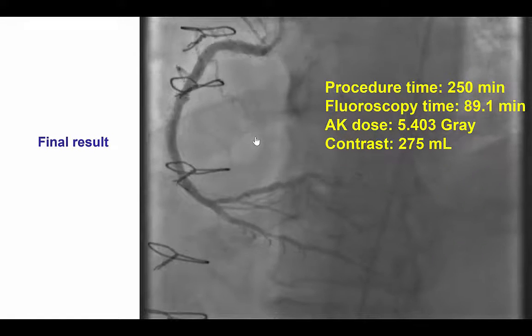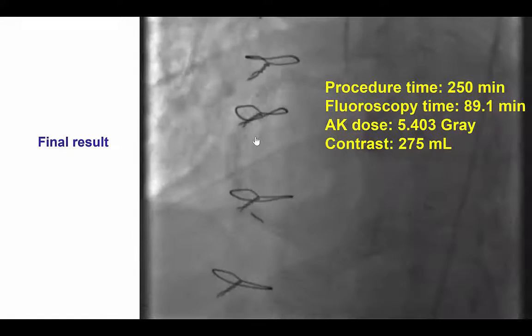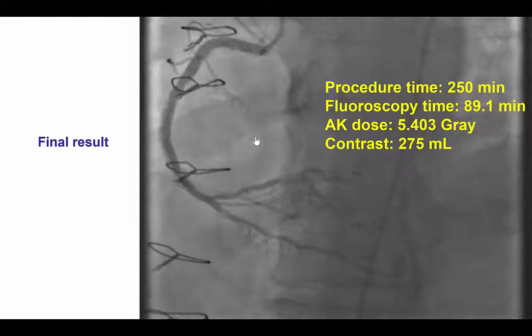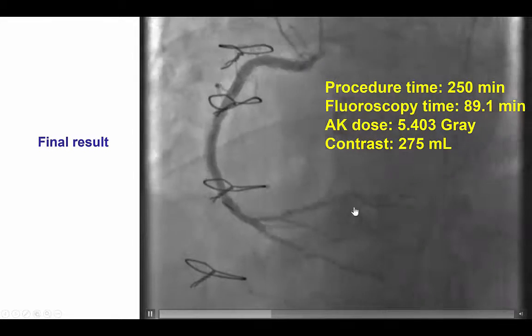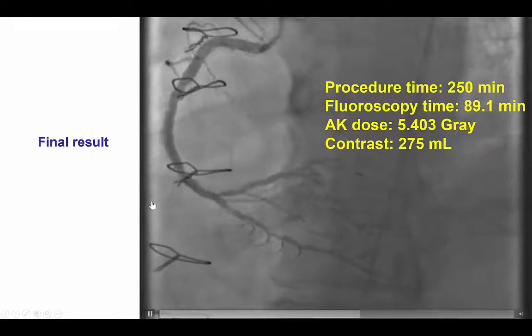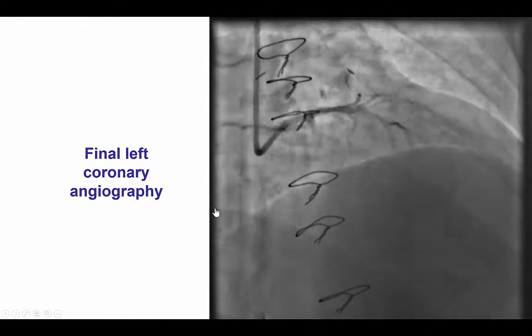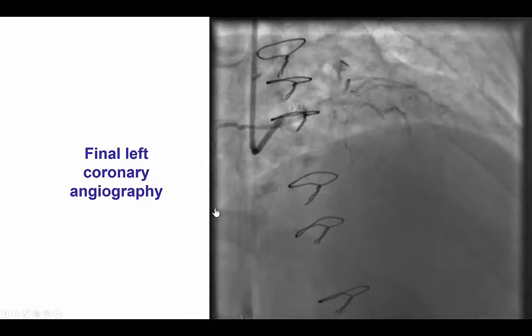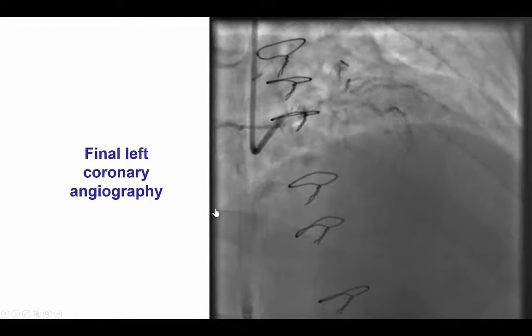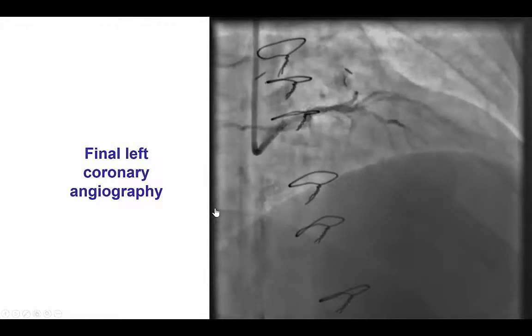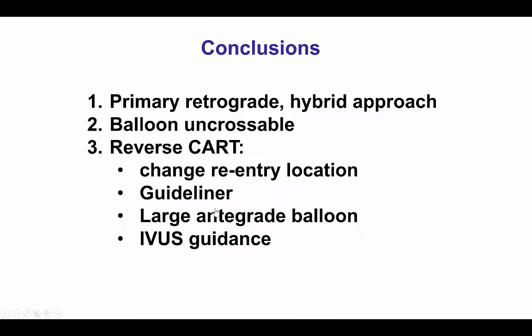After doing that, we were able to line the vessel with several drug-eluting stents, overlapping from distal to mid and to the proximal right coronary, all the way to the ostium, which were then post-dilated at high pressures with a 3.0 mm balloon, with a nice result. We have restoration of antegrade flow into the right coronary, with flow both in the PDA and the PLV, and the stents appear well expanded. As always in retrograde cases, we checked the vessel to make sure there was no perforation or injury, and indeed there was no such injury in the left system.